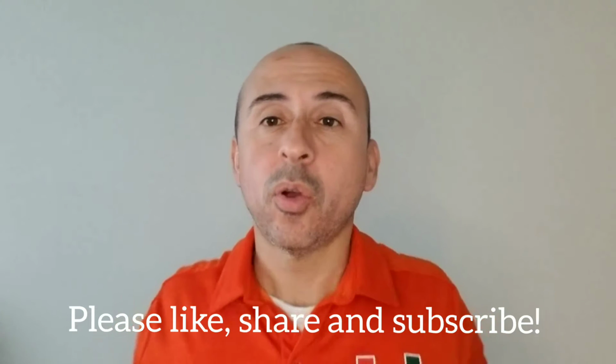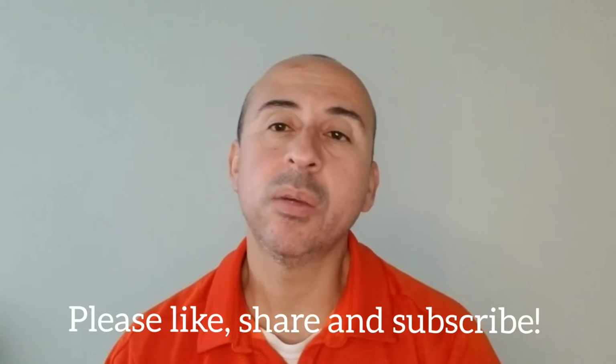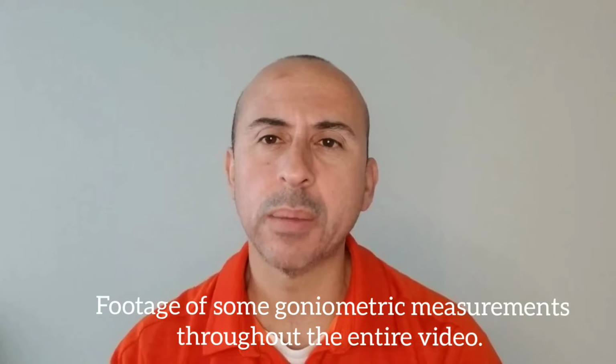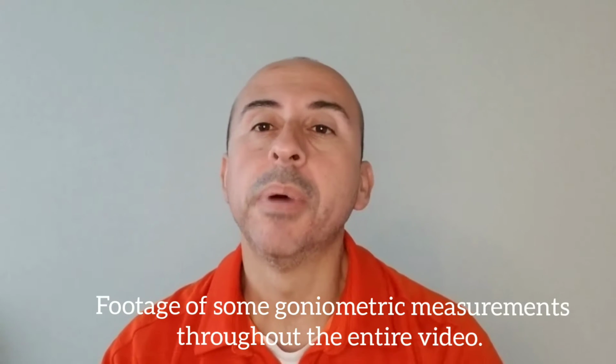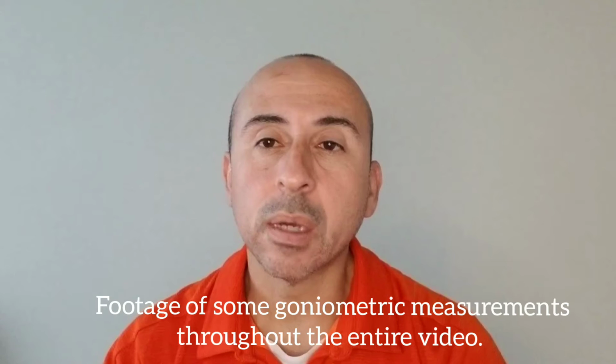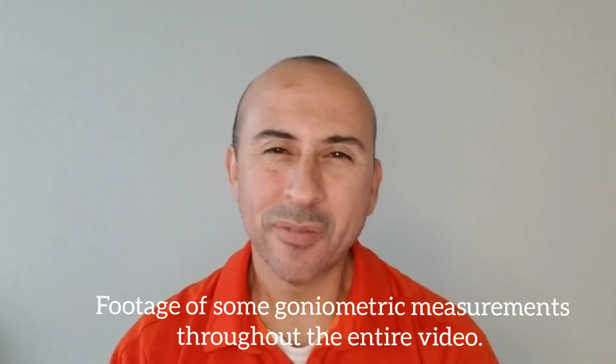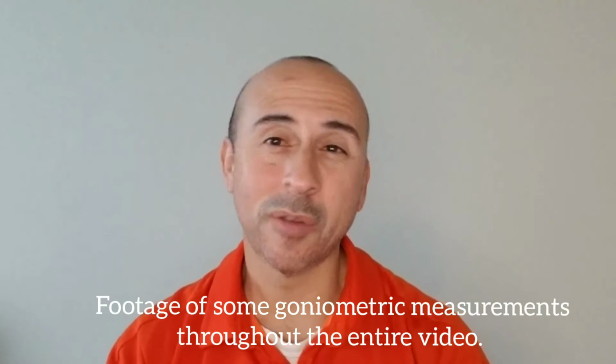Today we'll talk about goniometry again, but specifically with the shoulder joint and actually a little bit of the upper extremity. We'll do shoulder and maybe forearm stuff. But one of the things I would tell you to consider is that there's a difference when you're doing the goniometry stuff for a test, for testing purposes, and if you're going to do it for the clinic, because then you're going to be more practical about the whole thing. So I'll try to talk a little bit about both of the scenarios.